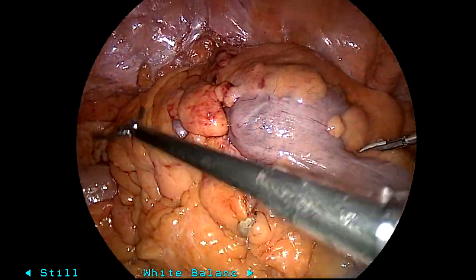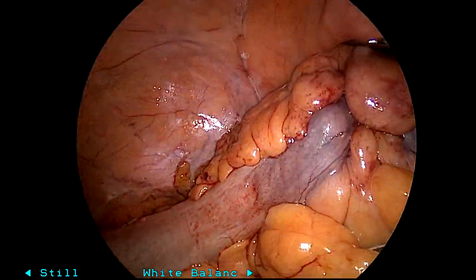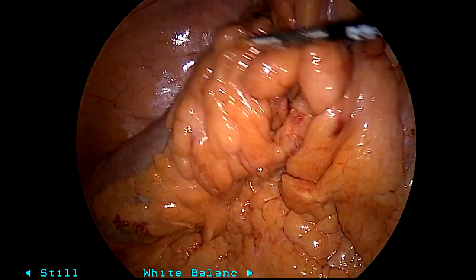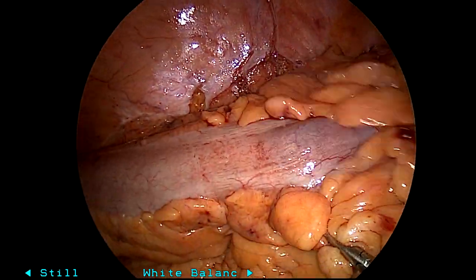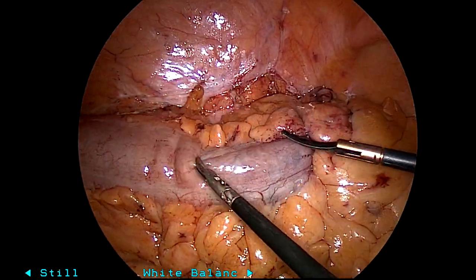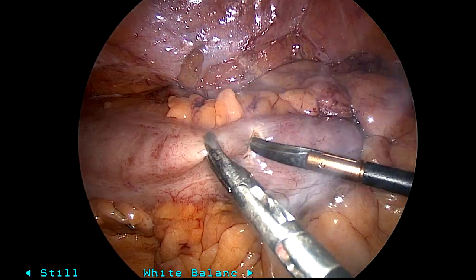I'm sharing a quick video of intracorporeal anvil placement for a sigmoid resection. This was a morbidly obese gentleman with a lot of medical comorbidities. I had already done all the mesenteric division as well as the lateral mobilization. You can see the area of demarcation right there where my left hand is grabbing.